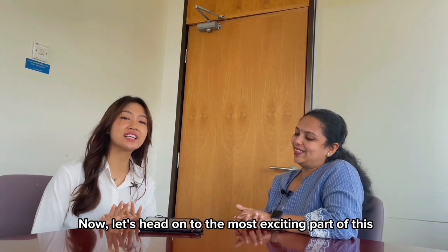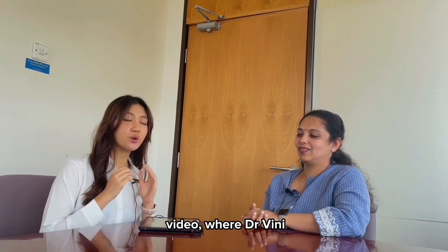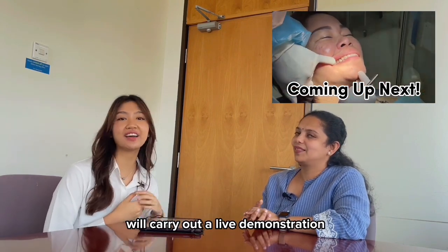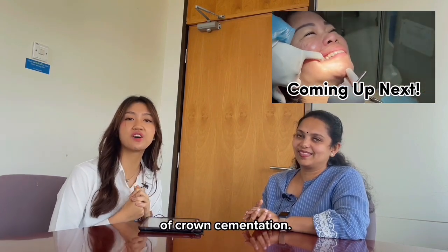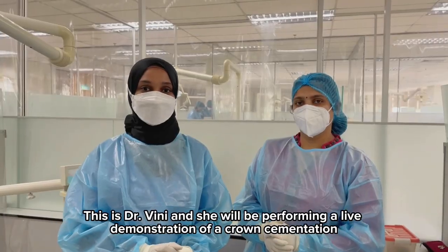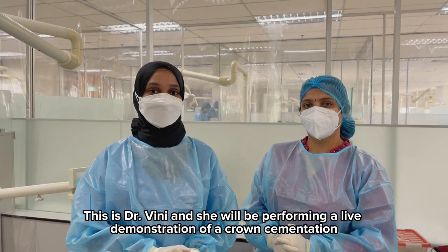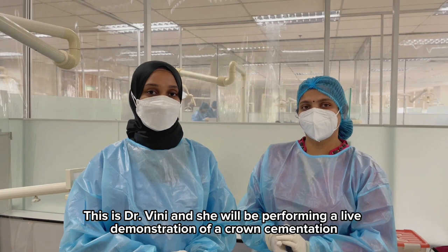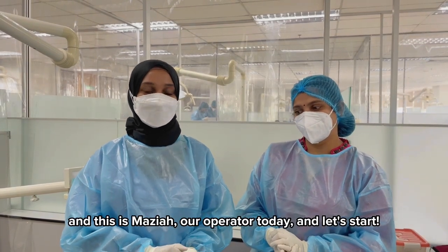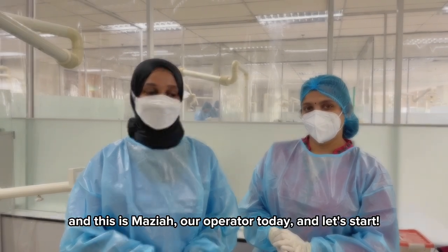Now let's move on to the most exciting part of this video, where Dr. Vinnie will carry out a live demonstration of crown cementation. This is Dr. Vinnie, and she will be performing a live demonstration of crown cementation. And let's start.